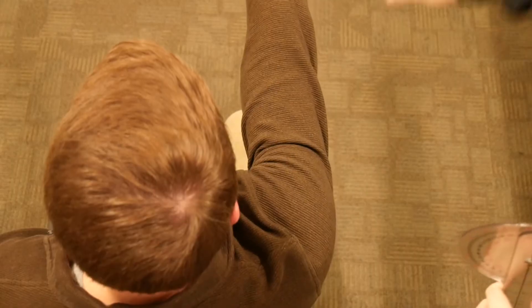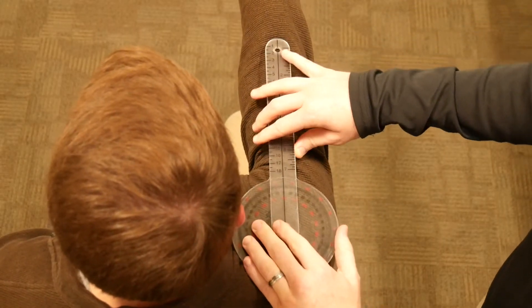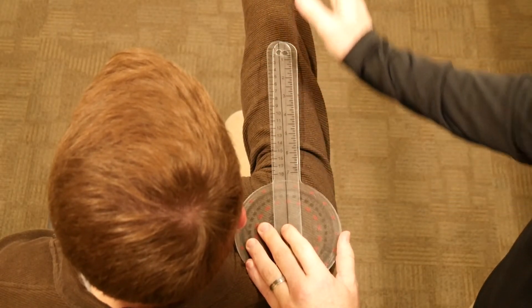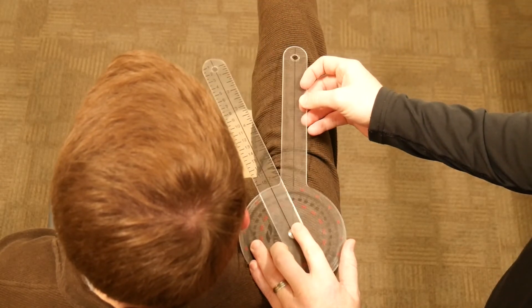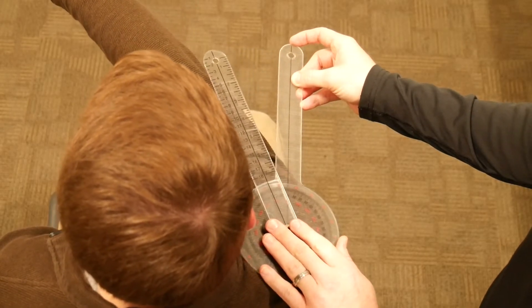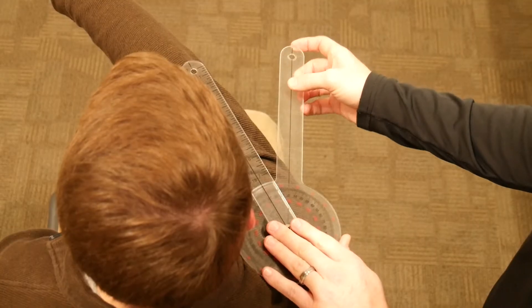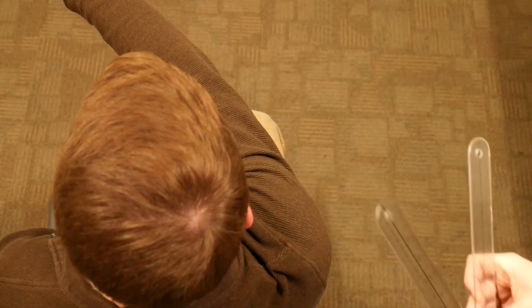Next we're going to talk about a shoulder motion that many therapists don't typically measure in the eval, but it's important to mention because if you perform impairment ratings, this measurement will be required. This is shoulder horizontal adduction. Ask the patient to reach out in front of them with the shoulder flexed at 90 degrees, place the goniometer right on top of the acromion process. The stable arm stays in line with the humerus at 90 degrees of flexion, and the movable arm follows the mid shaft of the humerus as the arm reaches across the body — you'll get a measurement of about 35 to 40 degrees, which is considered normal.